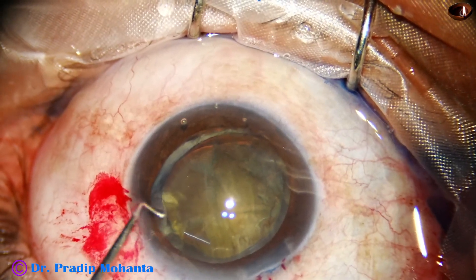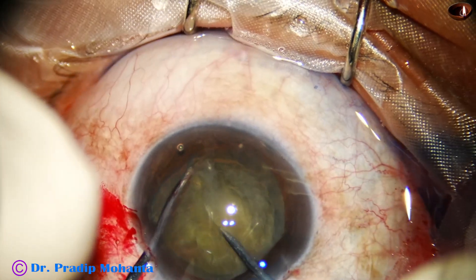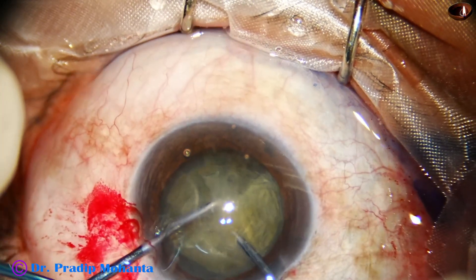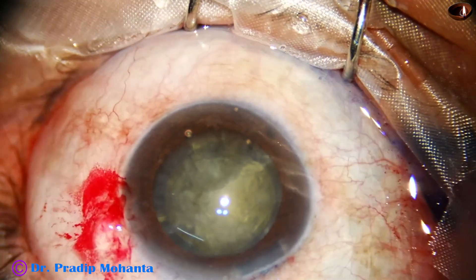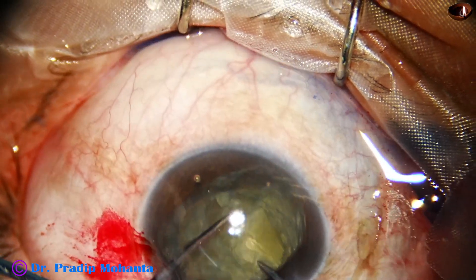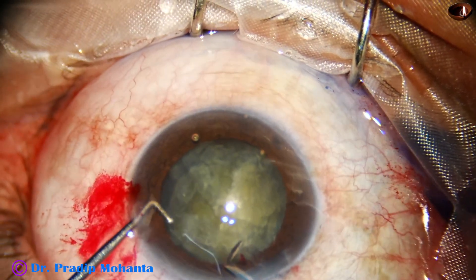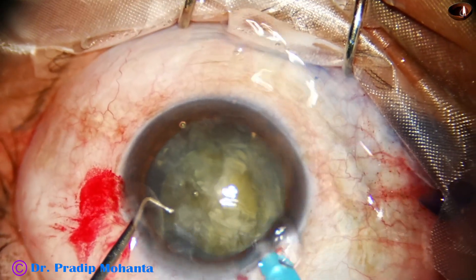The bag is supported. After injecting viscoelastic substance and dividing the nucleus with the pre-chopper designed by me — you can do direct chop also, but I am habituated to this and it has advantages in weak or dehiscent zonule because the irrigation pressure of the handpiece is not present. You are doing this under viscoelastic substance, supporting the equator with the nucleus sustainer, supporting each piece and dividing the inferior heminucleus into two pieces. Gently, you have to do all these steps. If you are not habituated to this pre-chop, you have to do direct chop very gently.